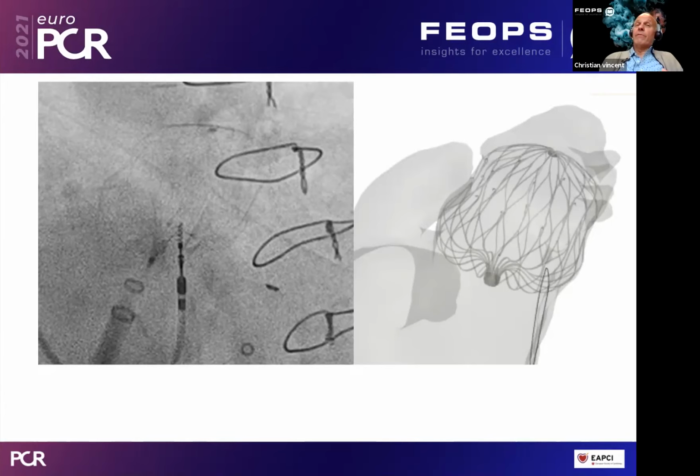Okay, and the very last question coming from the audience is: during the procedures, do you compare echo sizing versus the CT tools, or is it only with CT scan? And probably I can help you with this question. Of course, FEops HEARTguide is only based on CT scan. So that's clear.